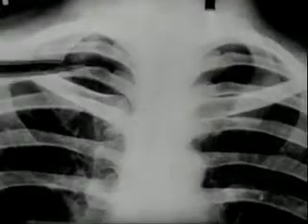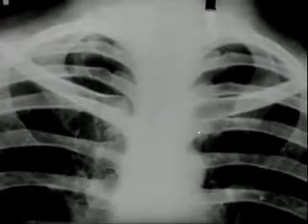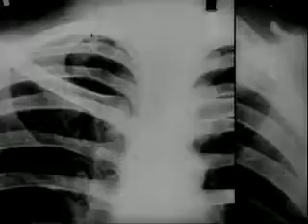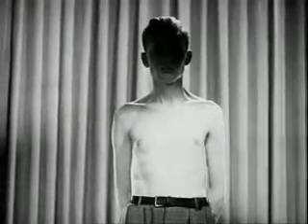In reinfection tuberculosis, this latent apical shadow gave no clinical symptoms nor any definite physical signs. This early infraclavicular infiltrate occurred in a medical student with only slight grippal symptoms and gave no obvious abnormal physical findings. This patient, markedly emaciated, had a profuse hemorrhage from the lungs.